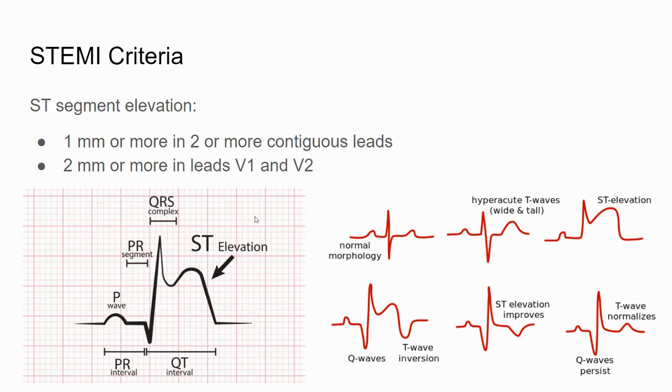And then, like I said, in next courses with more advanced 12-lead ECG interpretation, you'll look at all the different types of arrhythmias and know how to find them or name them. But for right now, the most important part, specifically with our ACS patients, is being able to identify this one rhythm, which is STEMI, standing for ST elevation myocardial infarction.